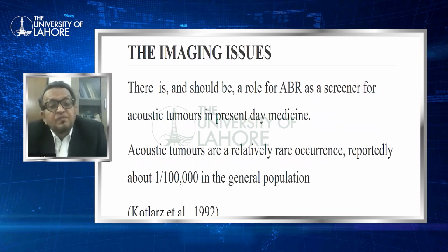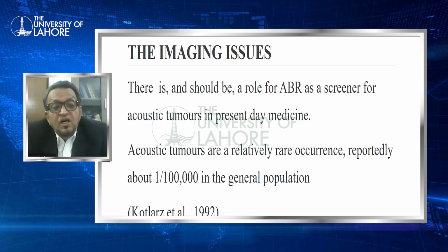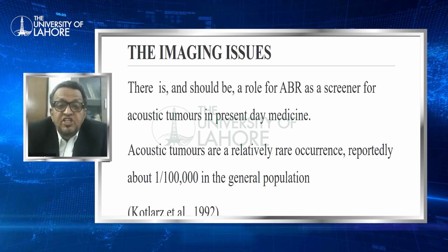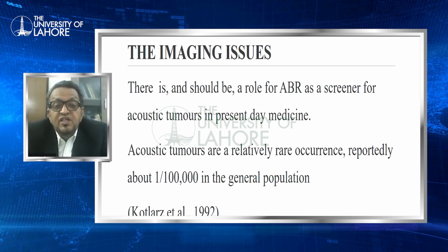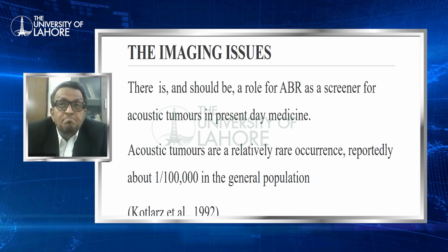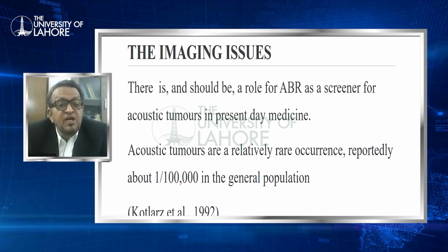The imaging issues. This generation of ABR makes it a very good mode of screening for acoustic tumors in present day medicine.